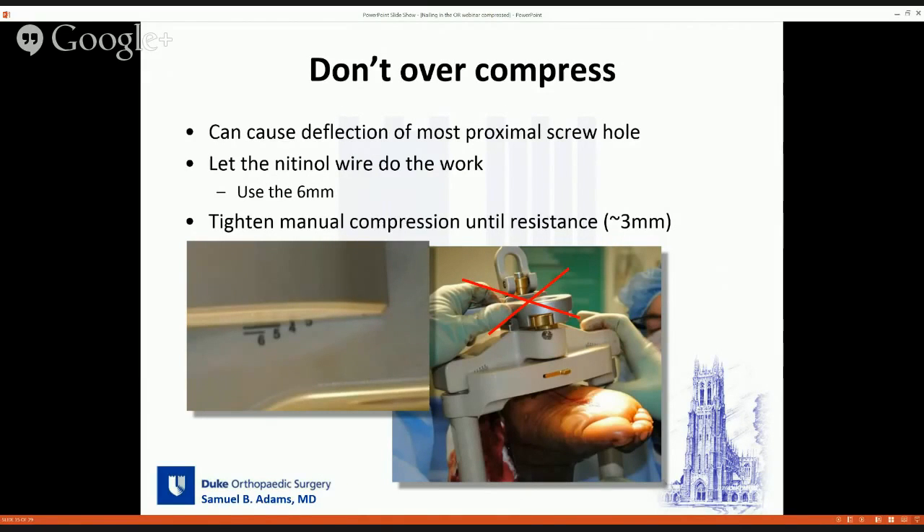You have six millimeters of potential compression from the nitinol element. I would always recommend doing the full six millimeters through the nitinol wire. For the additional external manual compression with the jig, when I first started doing these I would try to get an additional six millimeters, but the problem is the frame starts to deflect near the six millimeter mark, which can cause problems with proximal screws. I've gone to not going past about three millimeters of manual compression — if you have to use the wrench, that's probably the point to stop. I haven't had problems inserting proximal screws by limiting to three millimeters.